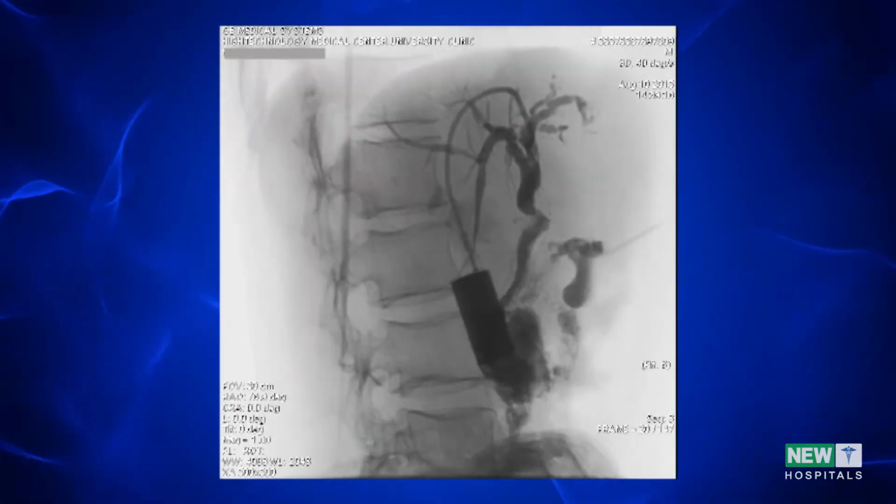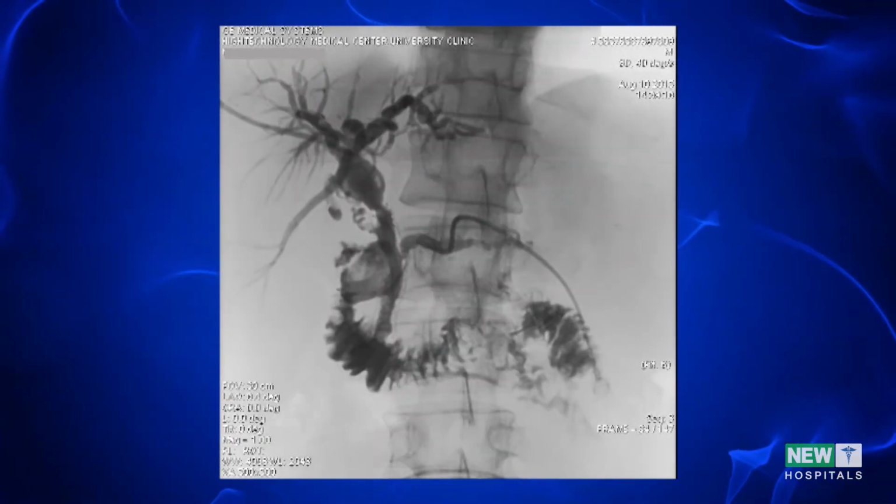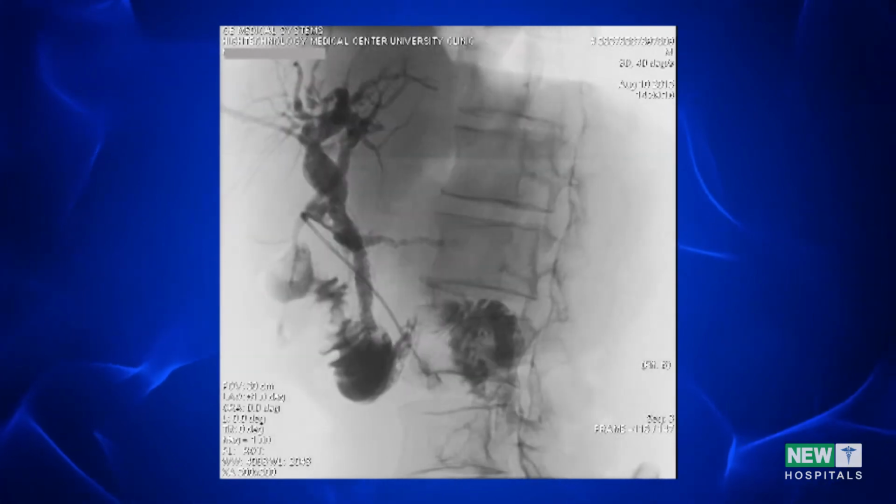Usually this is pancreatic duct obstruction recanalization. Depending on the cause of the obstruction, it might be stricture dilatation by balloon, stones pushed down into the duodenum, or different types of stent implantation. The existing drain facilitates the recanalization procedure a lot. However, it's possible to perform both drainage and recanalization simultaneously as a one-step intervention.